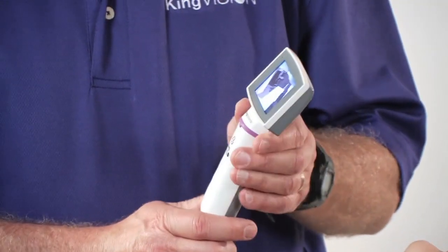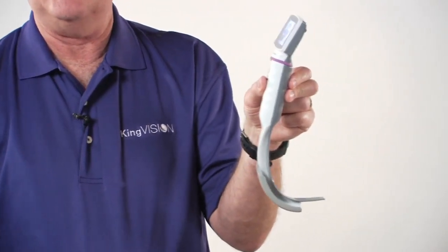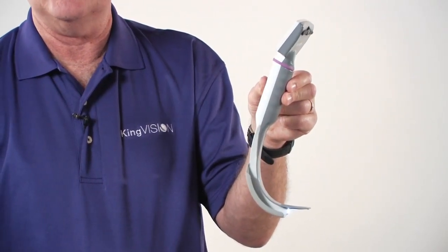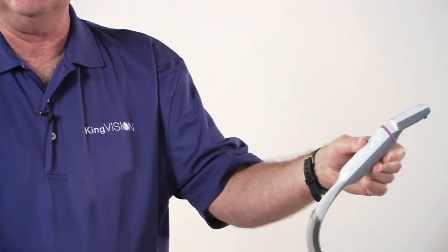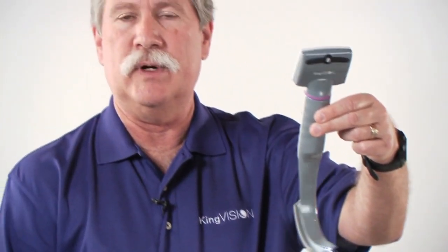If you disturb this connection after it's been attached, then one of two things will happen: it will either provide a frozen image or the screen could go blank. So it's important to hold this in a way to avoid lifting on the display and disturbing this connection in use. We suggest that you only need to grab it with a thumb and your first two fingers. This gives you a very good tactile feel as you're introducing the blade into the mouth, and also very fine control if you need to manipulate it once in the mouth.